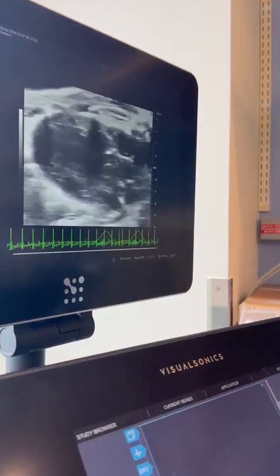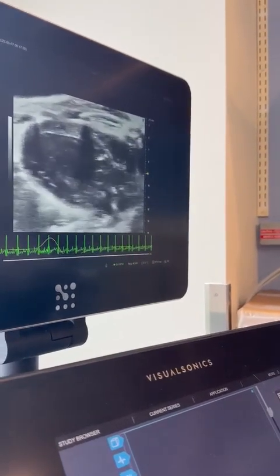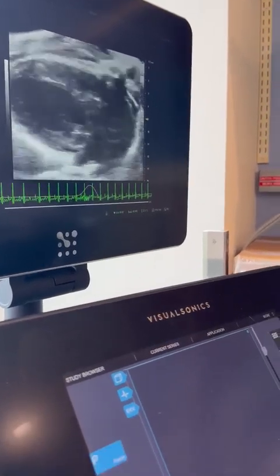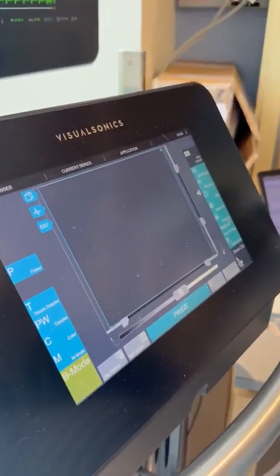Hey, look. Go a little bit further. We'll save more time. There you go. That should be nice. I'm just going to bring it back to the middle for us, but we'll need to refill that.